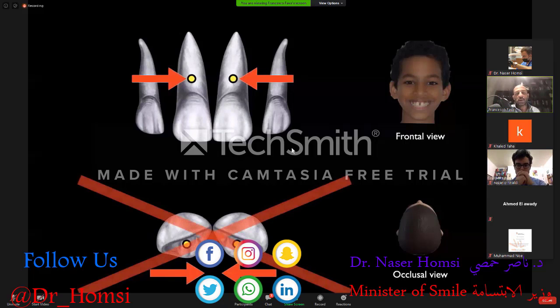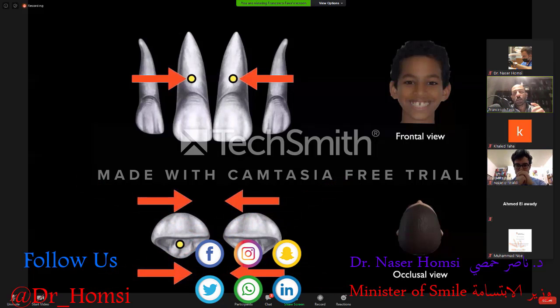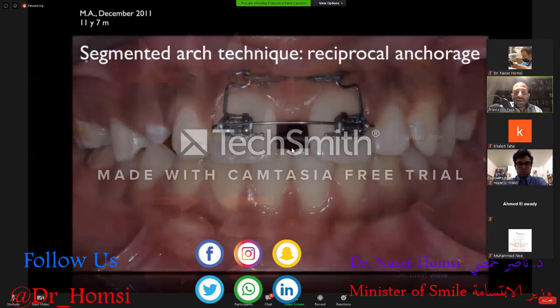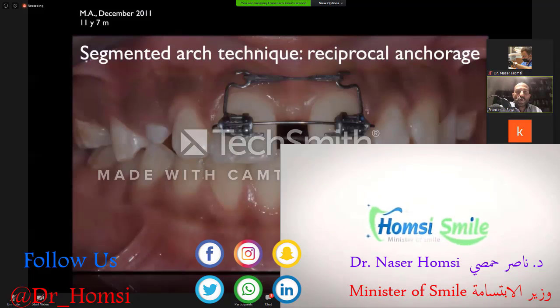The solution we decide to use is to apply a force both on the palatal and on the buccal side, creating a so-called double cable mechanics, which means to apply forces on both sides of a tooth to prevent undesired rotation. And this is what we decide to do, very easy cases for Mohamed.